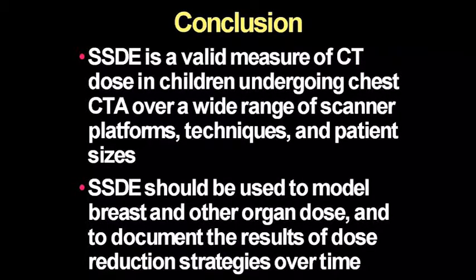So in conclusion, we found that the SSDE is a valid measure of CT dose not just in the lab, not just with phantoms, but on actual patients doing clinical measurements as we were doing this for some time, over a very wide range of scanner platforms, techniques, and patient sizes. And we had patients that were overweight, adult size, and we had patients who were premature babies. So a tremendous range. That is the range that we deal with in pediatric radiology.